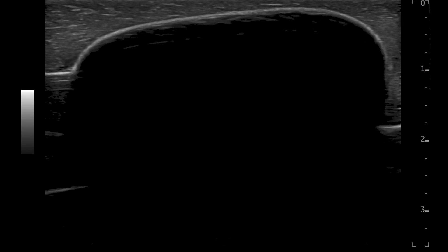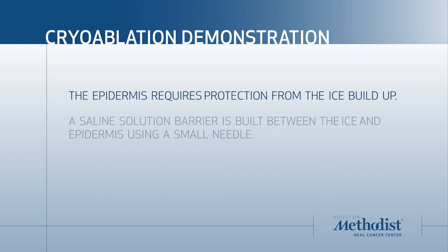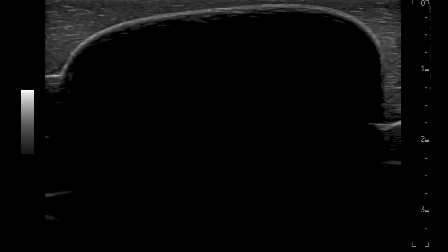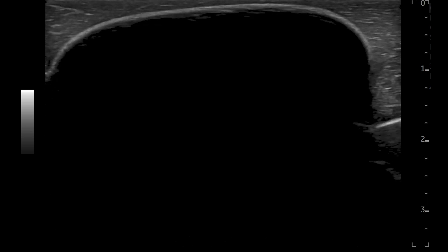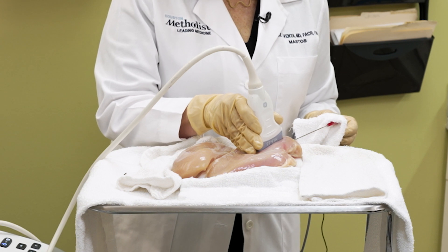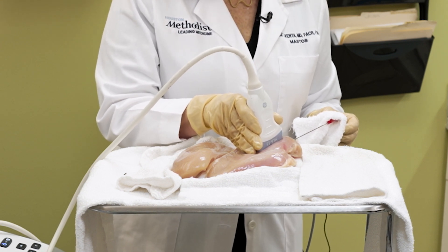As the ice ball expands, it approaches the surface, simulating the proximity to the skin in an actual patient. To protect the skin in real cases, a small needle would be placed underneath the skin, delivering fluid to create a barrier between the skin and the ice ball. However, for this demonstration, we are utilizing an active thaw. During the thawing phase, if the target or tumor being addressed is sufficiently large, adjustments to the probe's position are made to ensure comprehensive coverage of the desired area that may have been missed previously.